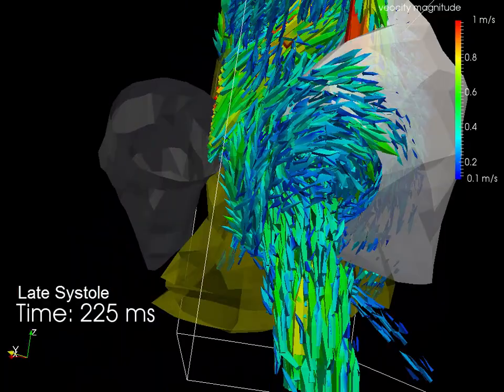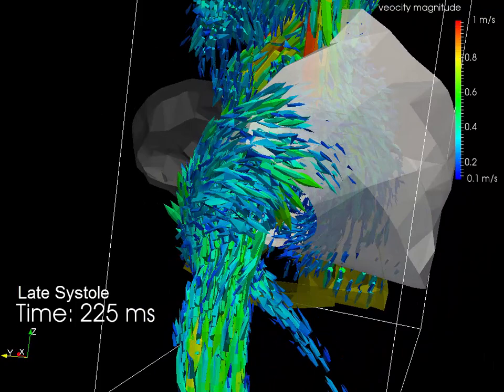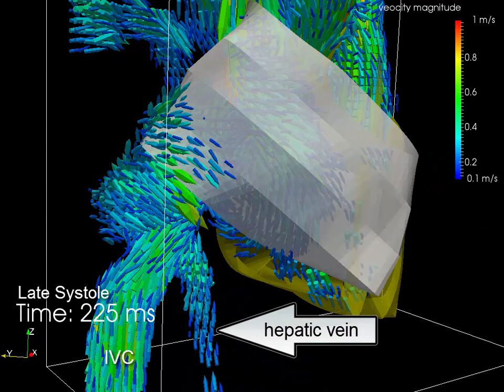We can see flow entering from the bottom through the inferior vena cava and the hepatic veins. The hepatic vein flow wraps around the inferior vena cava causing mixing.